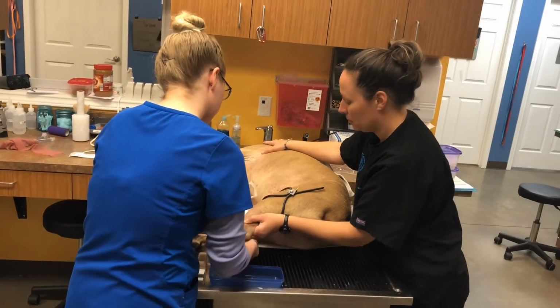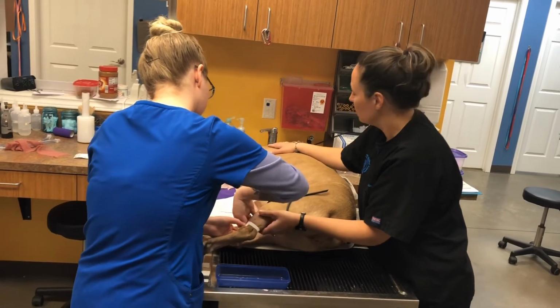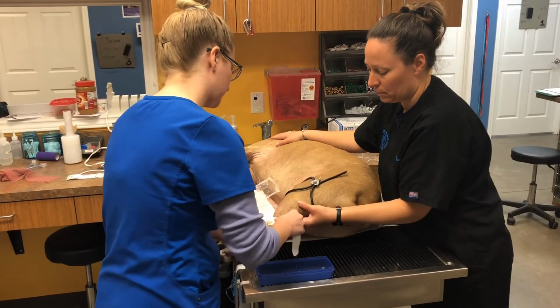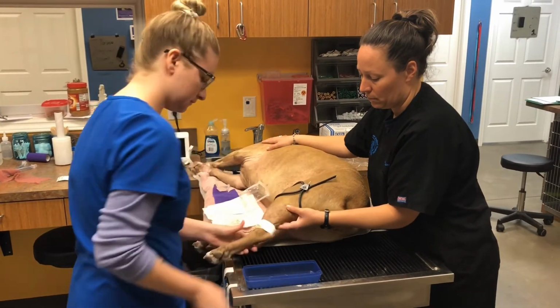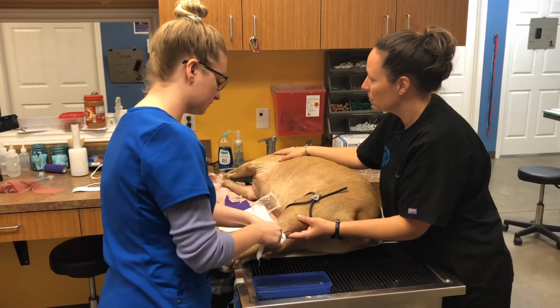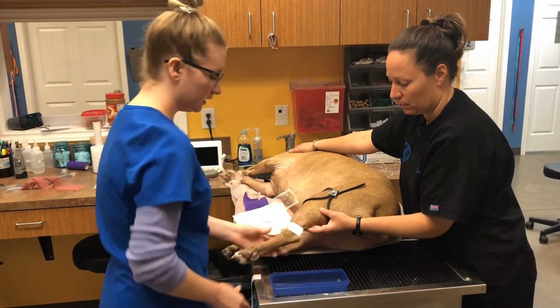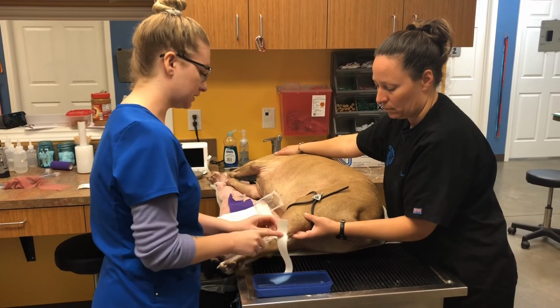And I'll start with my first piece of tape, a skinny piece of tape with the sticky side up. The second piece of tape is the thick piece with the notch in it to secure the T-set. My third piece is another skinny piece. We're going to twist it in the middle to secure the T-set again. And the last piece is a full piece of tape, and we're going to use that to secure this other extension line.